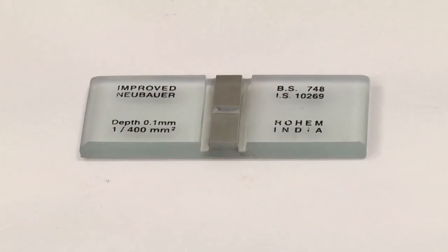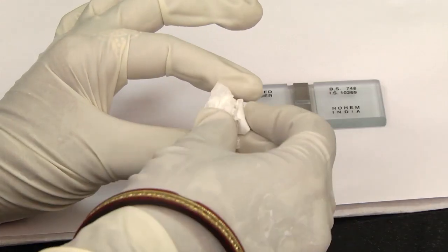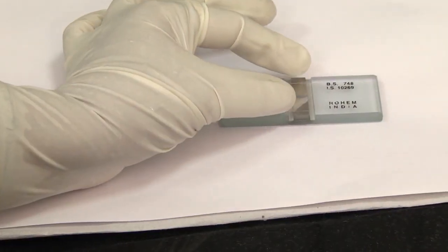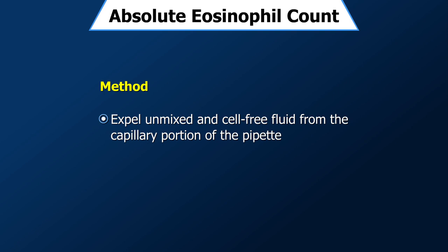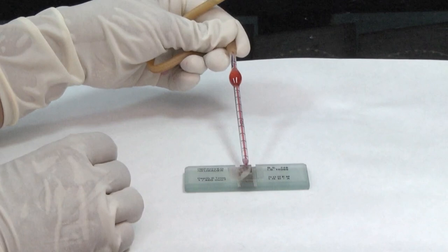Prepare the counting chamber. Clean the mirror-like polished surface carefully with lens paper. The cover slip is also cleaned and placed over the counting surface prior to putting on the cell suspension. Expel the unmixed, relatively cell-free fluid from the capillary portion of the pipette, which is usually 4 drops.